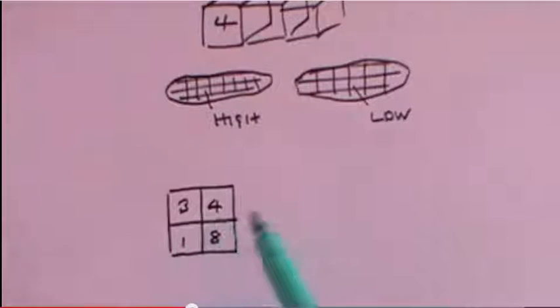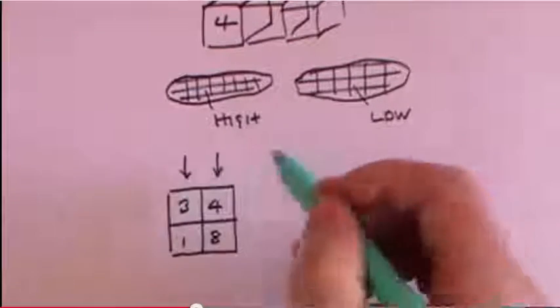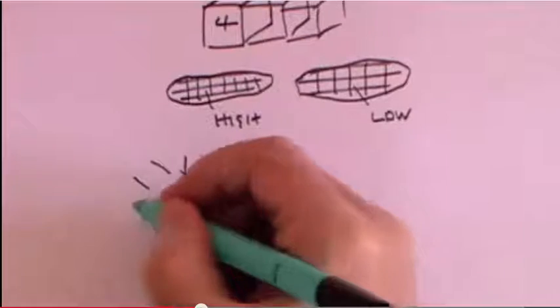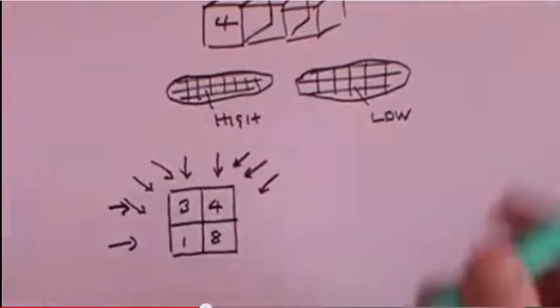Then the algorithm sums all of this, and in the end we have a number of equations, but with the same variables, and that lets the algorithm solve that equation.